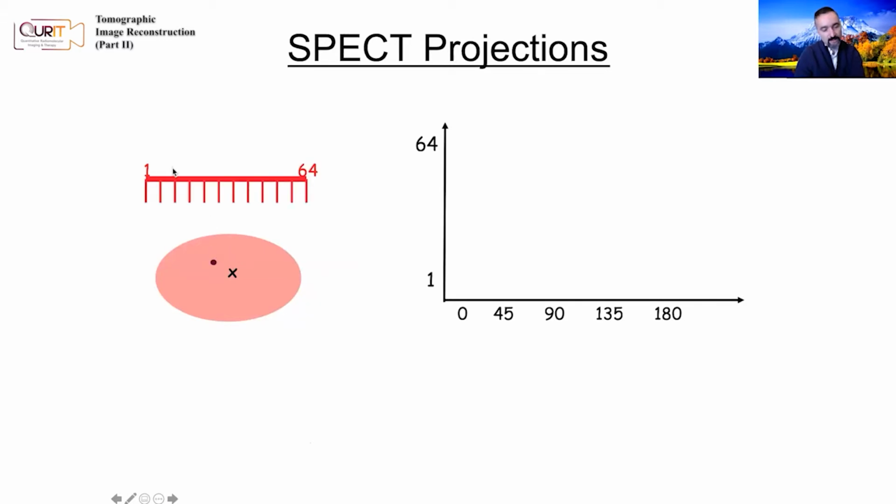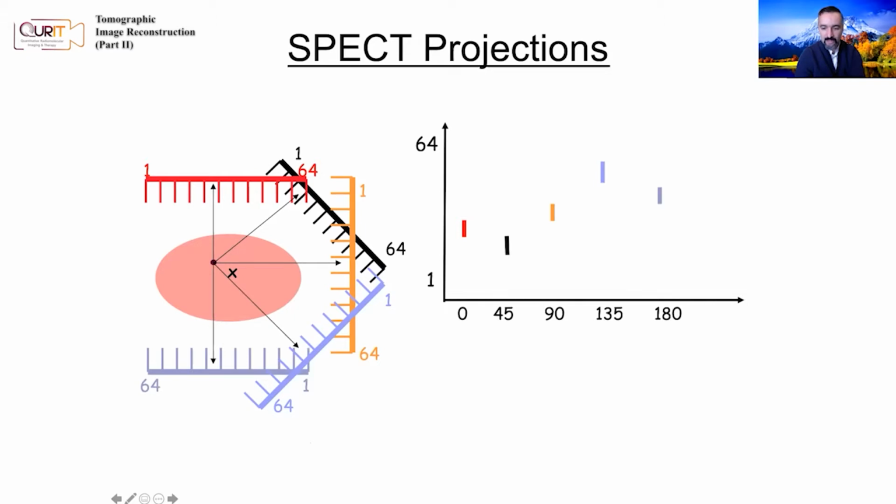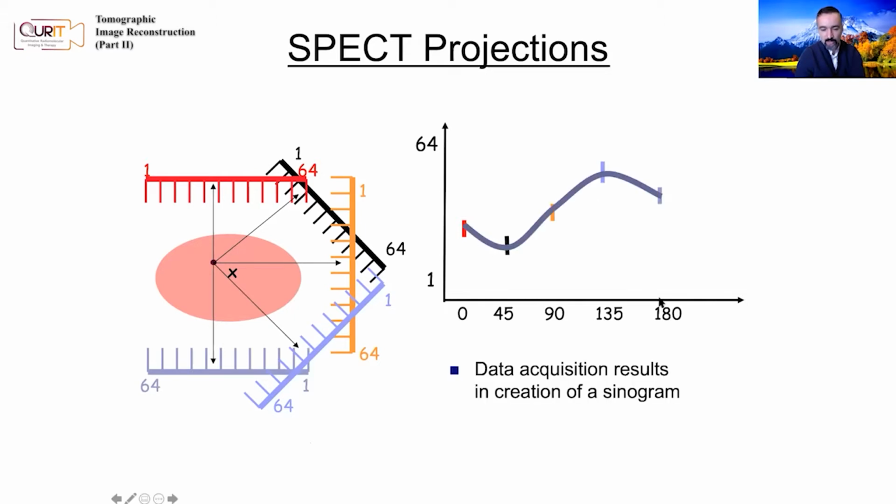You've got, for example, a SPECT camera here. So you do a measurement. But as you rotate it, the relative position that you measure with respect to the center of the camera changes. Here, perhaps it was closer to the center. Here, it's less close to the center, so it moves down. The center is here. And then as you do this, now it becomes more centered, et cetera. So it moves around, and you get this sinusoidal curve.